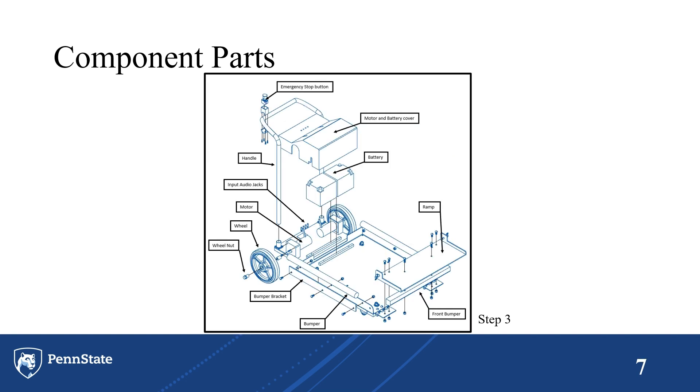Step three features all the final components: the ramp, all the bumpers, and the wheel assembly. This is where we assemble the electronic components and the battery, all being covered with the motor and battery cover. It also features a handle with an emergency stop button for the PT.